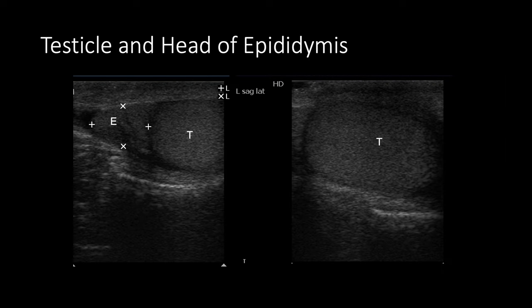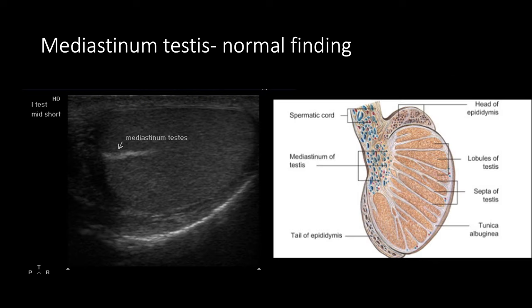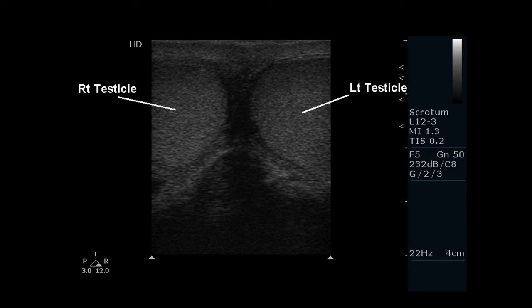The normal testicle appears very homogeneous on ultrasound. Scanning more superiorly you'll see the epididymal head, which also looks homogeneous and slightly separated from the testicle. The mediastinum testis is a bright white line seen in the middle of the testicle, particularly on short axis — this is completely normal. The 'buddy shot' — imaging both testicles simultaneously — lets you compare echogenicity and identify differences from torsion or mass.